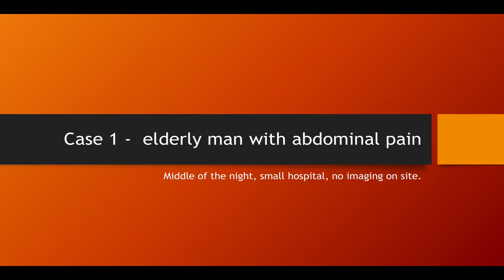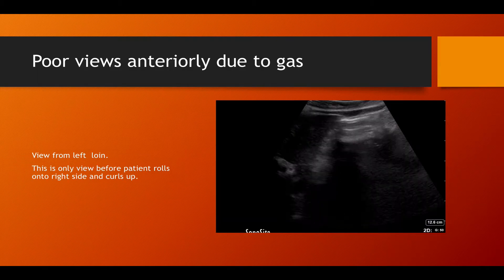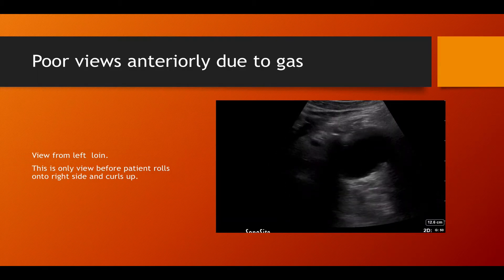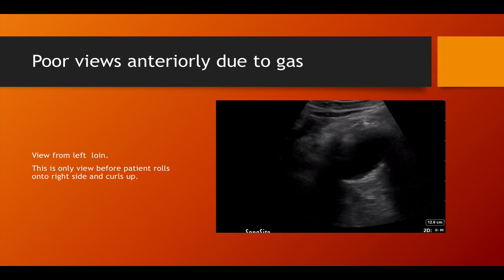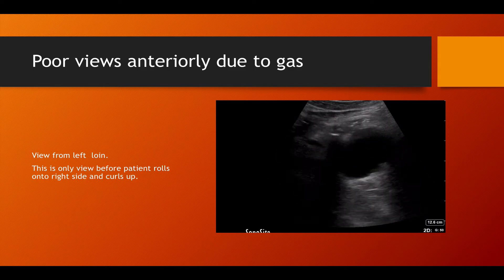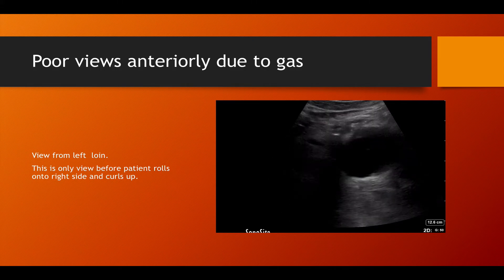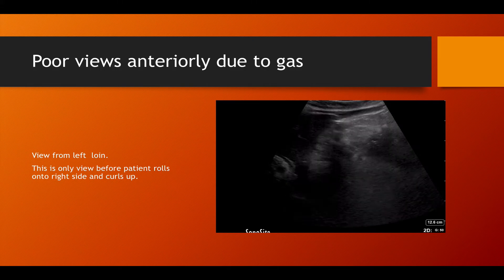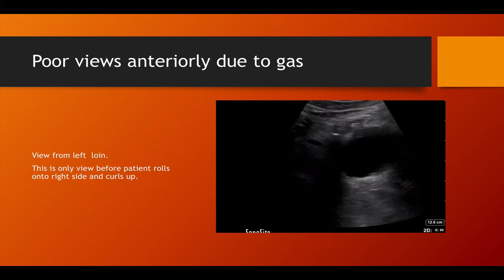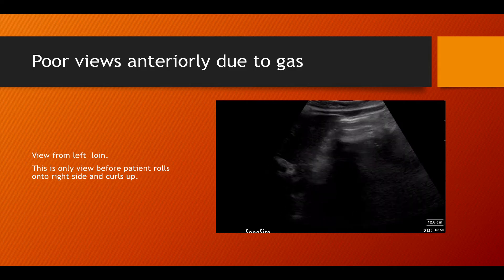The first case is an elderly man with abdominal pain. It's the middle of the night, a small hospital, and there's no formal imaging available — this is the only view you get. The patient is very distressed, not holding still, curling up on the right side, and all we have is this one view from the left. The question is: can you make a call on this? Is this a AAA?